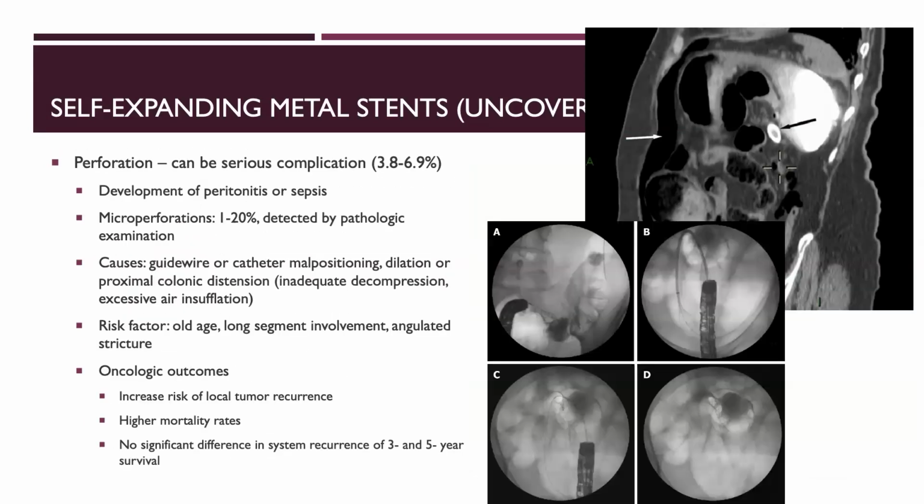Okay. And then as I go back in terms of these types of stenting, these pictures are fluoroscopy pictures showing very complex stents. What you see here is this tight angulation, and it's in these patients that inadequate decompression may happen, that they are likely to feel the stent, that they may get pain from the stent because of how tight these angulations are, and that they may reocclude.